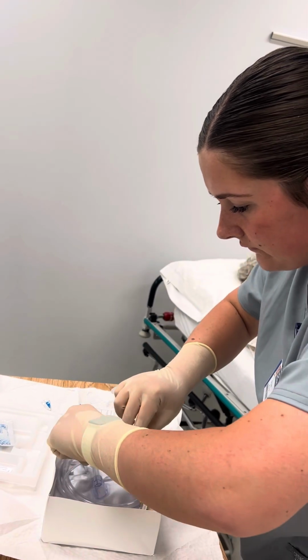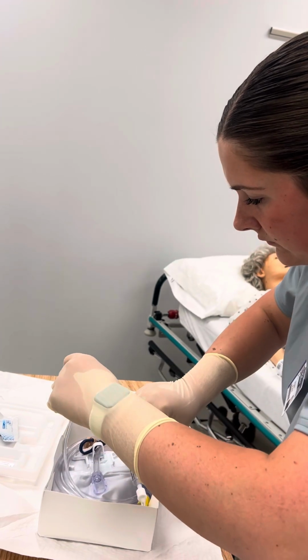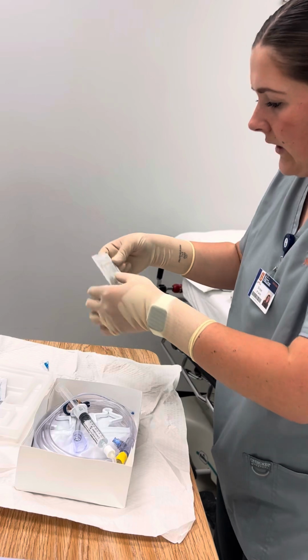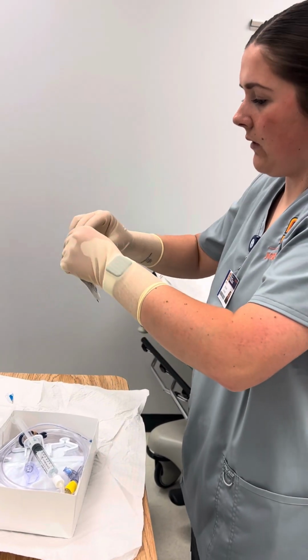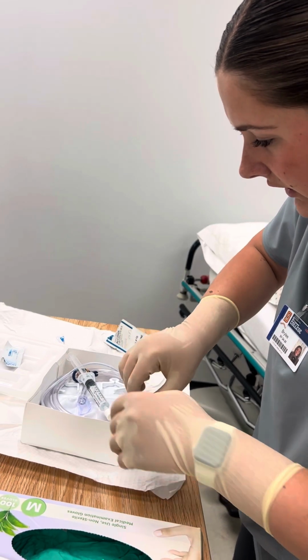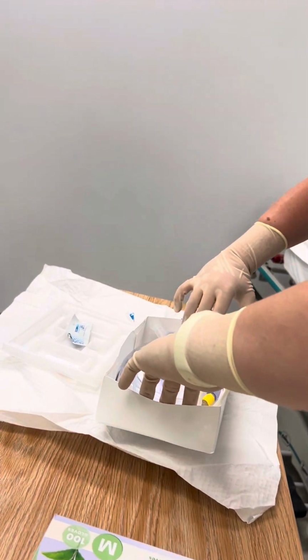And I'm going to just attach my flush really quick, for the bubble. And then these are my cleansing wipes. I'm just gonna get these ready. Okay, I'm gonna move this over to my patient.